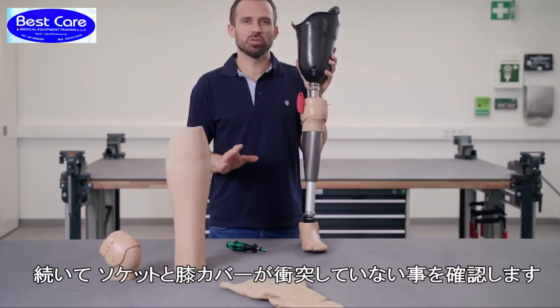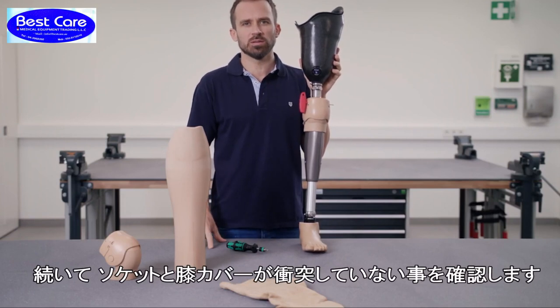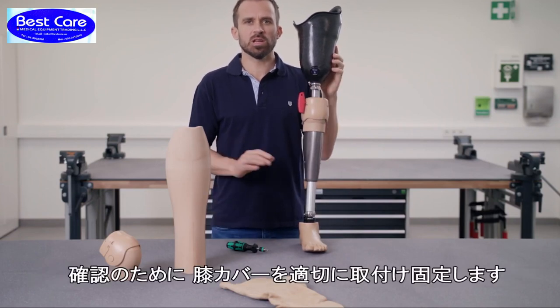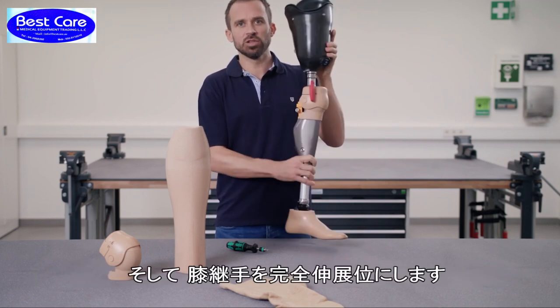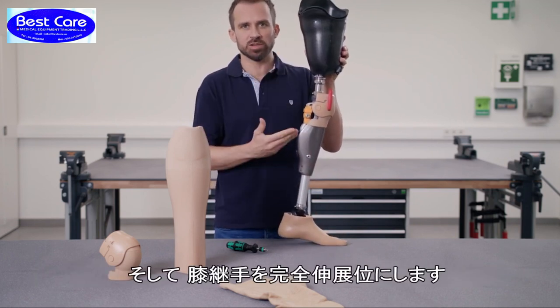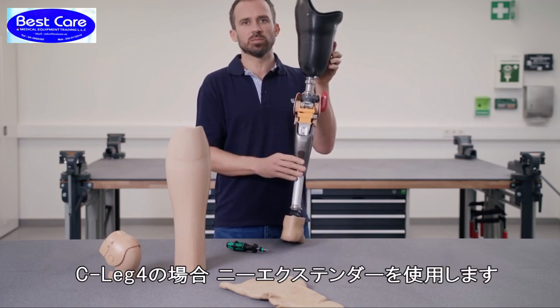Next, it is important to check whether the socket and the functional knee part collide with one another. To do this, the knee part must first be provisionally installed and secured, and the knee joint must be moved to maximum extension. You will need to use the knee extender here for the C-Leg 4. Let me show you.